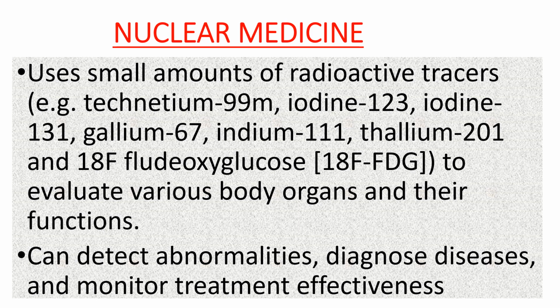Nuclear medicine modality uses small amounts of radioactive tracers, such as technetium-99, metastable technetium-99, iodine-123, iodine-131, gallium-67, indium-111, thallium-201, and 18F fluorodeoxyglucose. It uses them to evaluate various body organs and their functions. It can detect abnormalities, diagnose diseases, and monitor treatment effectiveness.